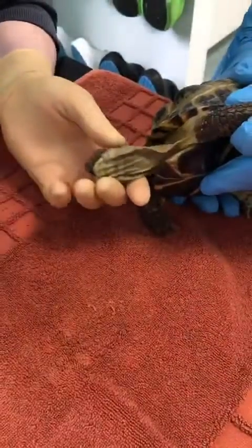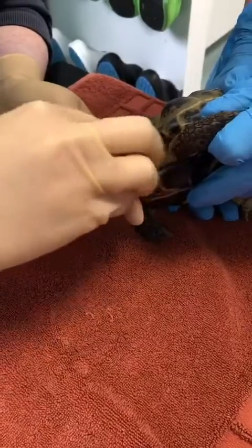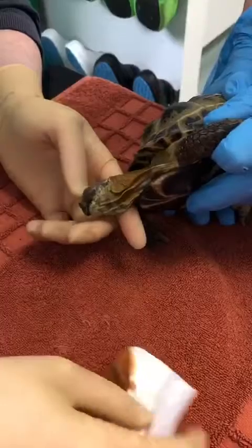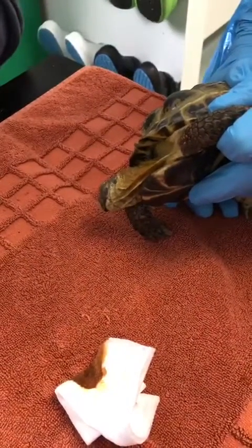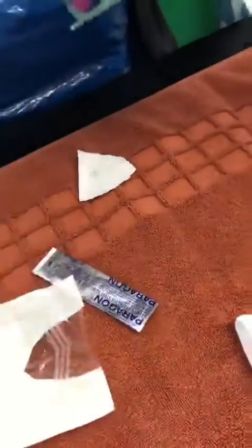Today we are going to place an esophagostomy tube in a tortoise. First we want to clean the area with a little bit of iodine. Our patient is already sedated. We then want to place and pre-measure our tube.